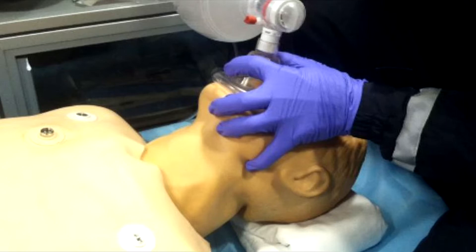He's got the EC clamp going on — something we've all been taught early in our medical training. EC clamp: three fingers on the bony prominence of the mandible displacing it upwards, and the other two fingers encompassing the BVM mask to get a proper seal, getting the best seal possible with just that one hand while also ventilating the patient.